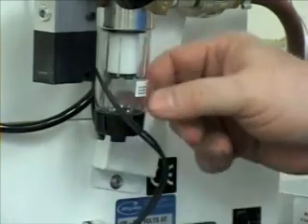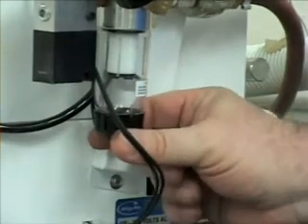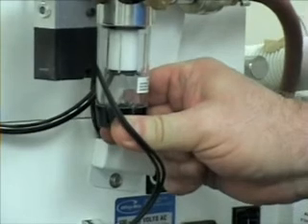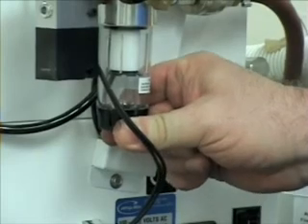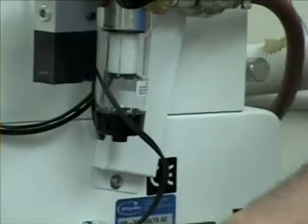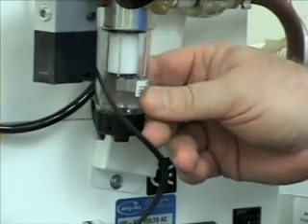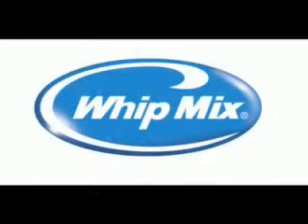The way to drain that or get that moisture out of the system is to simply place your thumb and forefinger underneath on this black plastic ring and press upwards until you hear a whooshing sound. That whooshing sound is just the check valve opening when you push the ring up, and it's blowing the moisture out of the system, and it will exit down here below the ring. Blowing that dry once a week is a pretty good way to prevent any excess moisture accumulation from going through the regulator.